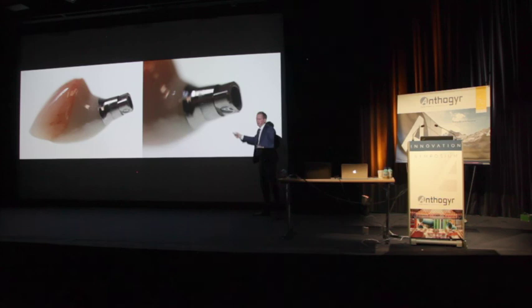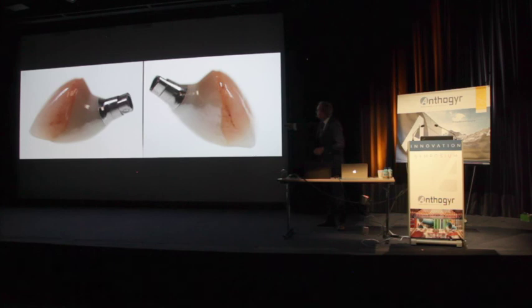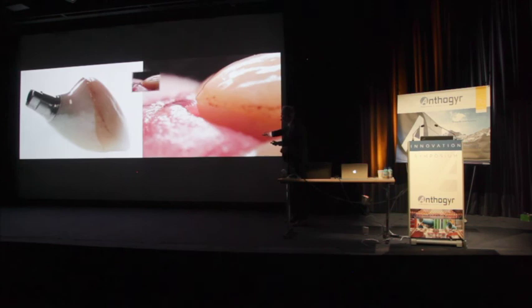Look at the little A and the little logo here, it's important. And also, don't polish the connection part. This is why you see this dark line. Above this line, everything is polished. Below this line, we should not touch it. That keeps the precision in our components. And the same shape is now visible. And here you have the concavity that goes on under that margin and stabilizes it.